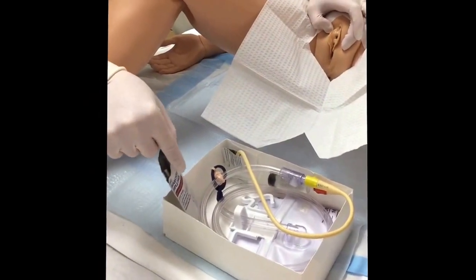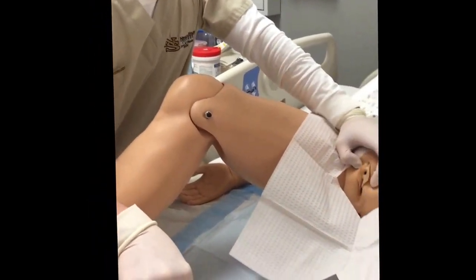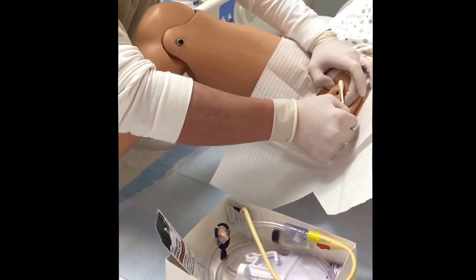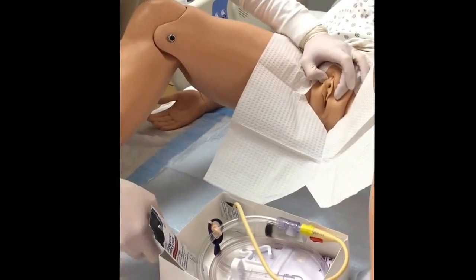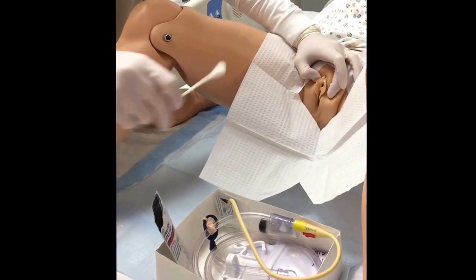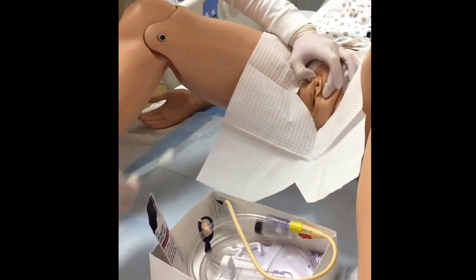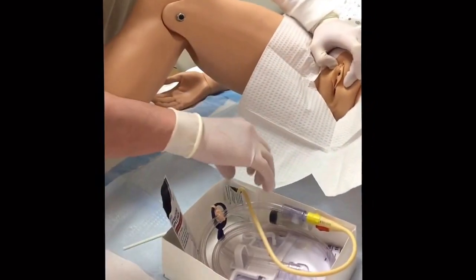Okay. Usually, if this happens, you always have 5 swab sticks. You do one wipe from front to back on your labia minora and labia majora, and then one wipe from front to back again from the meatus down to the vaginal area. All right. So that's after that, and everything's good.